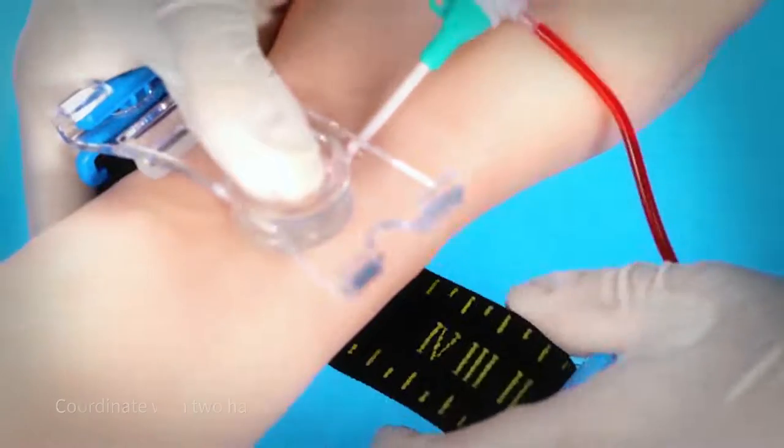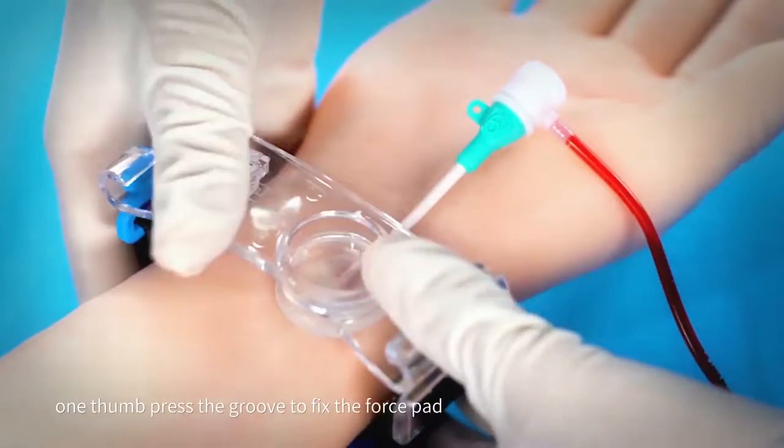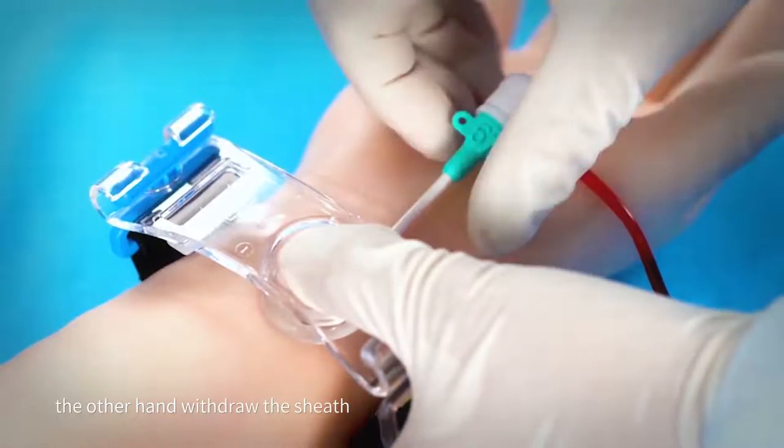Coordinate with two hands. One thumb presses the groove to fix the force pad. The other hand withdraws the sheath.